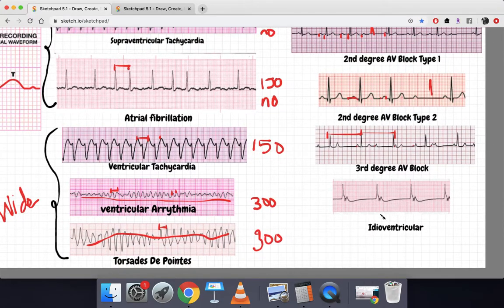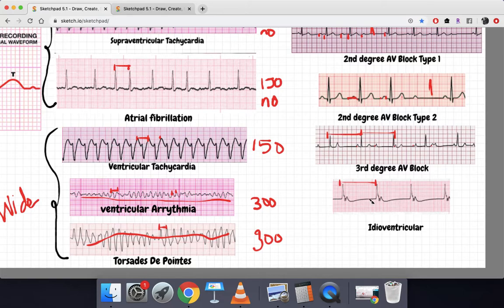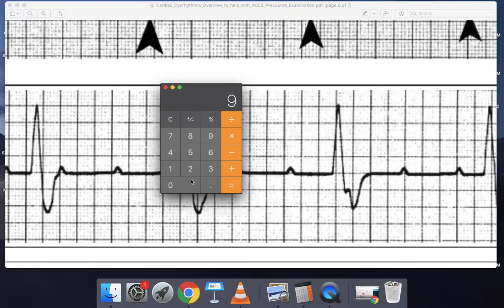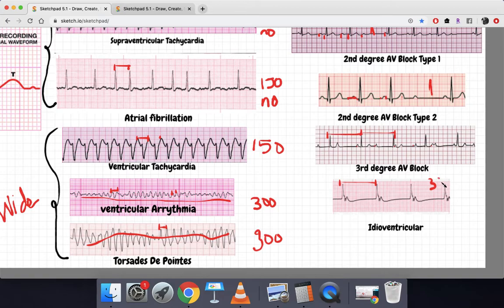Now idioventricular arrhythmia — this one is very pathognomonic. It's going to look exactly like this; there's not much to explain, you just have to remember what it looks like. This is obviously a decreased heart rate — let's count: one, two, three, four, five, six, seven, eight, nine — almost nine boxes. So 300 divided by 9 is 33 beats per minute. Idioventricular arrhythmias usually occur after reperfusion.